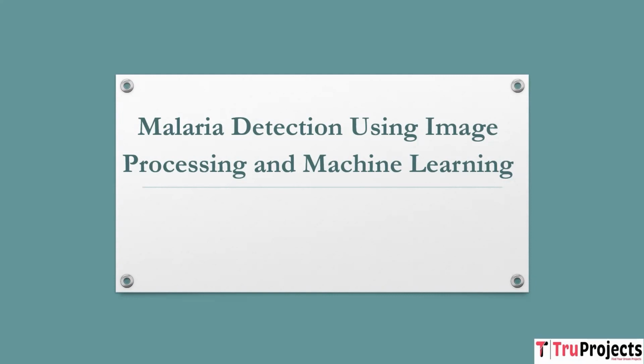Welcome to True Projects. In this video, we are going to explain the project, which is malaria detection using image processing and machine learning.